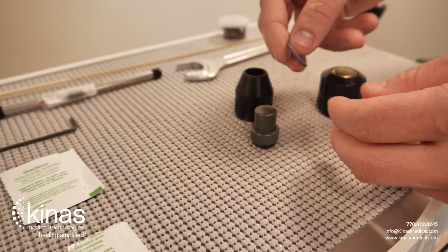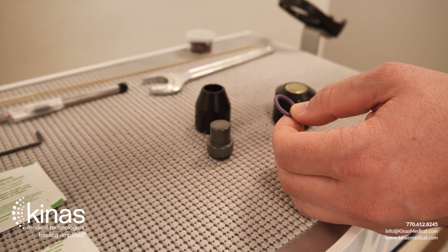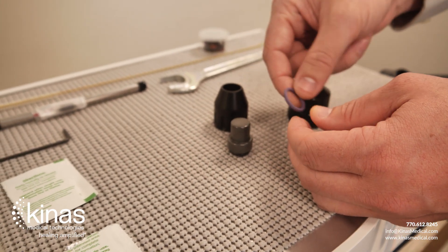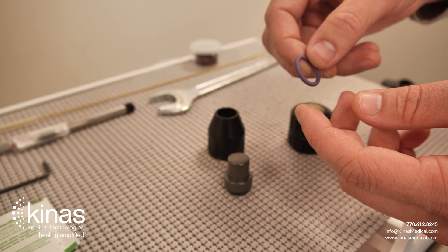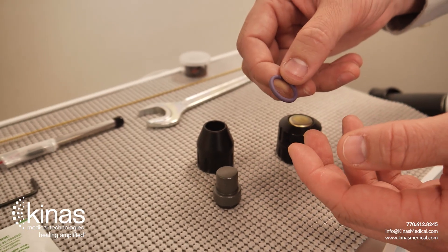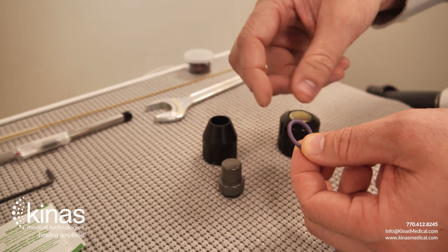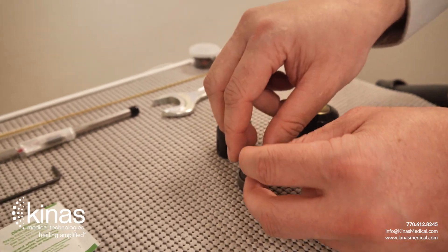When you clean the transmitter tips, you can run hot water and a toothbrush — that'll take care of any debris left on there or ultrasound gel. You want to make sure that there's no tearing or fraying of the O-ring, or if it's been stretched out. But this one's in good shape, so we'll put it back on.